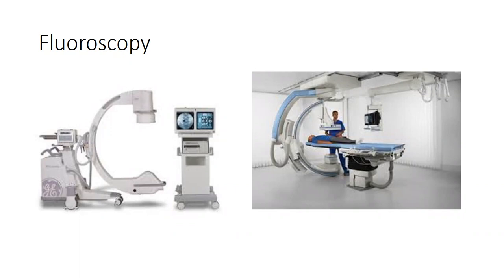So when you want to study how someone swallows, have them swallow some barium and watch them chew. That's the other really cool thing about fluoroscopy, it's not just a static image. You can let it run and continuously record, and you can get video of things in motion. So you can watch the coronary arteries perfuse. You can watch an instrument being passed safely into a space. You can watch, like we said, a swallowing evaluation, all in real time.